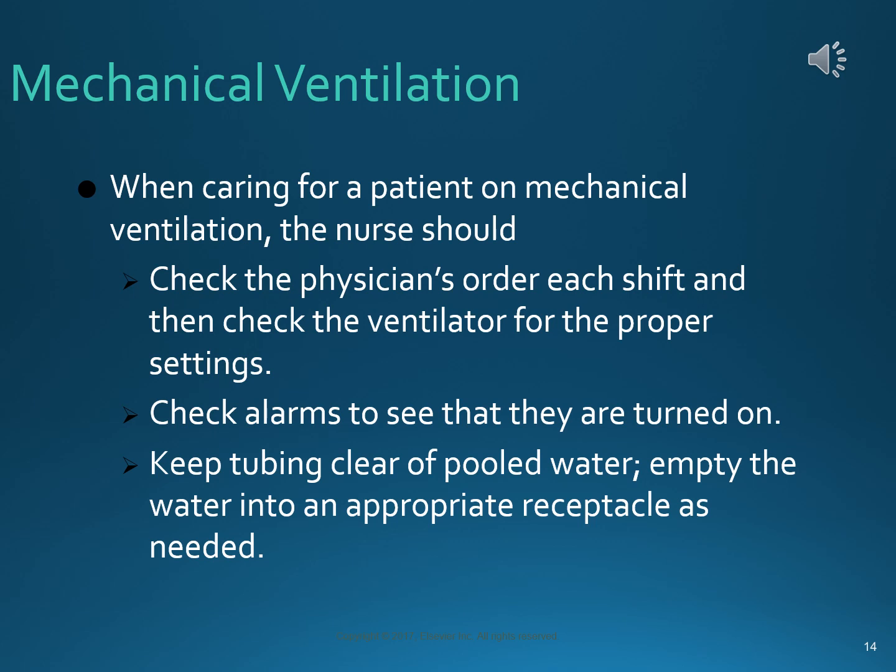This is a thing that is a real problem when people turn the alarms off. In fact, there was this respiratory therapist at a facility a short while back who would go around and turn the alarms off during the night so that they didn't get bothered. And there were quite a few things that got missed during the day, patients who got in trouble that nobody realized because their alarms were off. So needless to say, that person was reprimanded for that, and that is not a good policy. Always keep those alarms on.